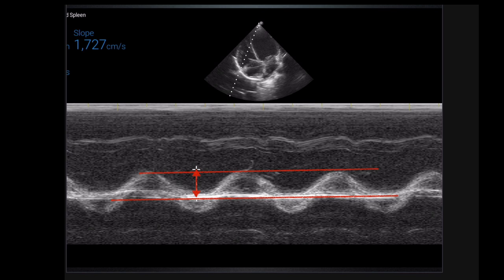TAPSE stands for Tricuspid Annular Plane Systolic Excursion — how much the tricuspid annulus moves per contraction. To measure it, put an M-mode cursor through the tricuspid annulus in apical four and measure the distance between the peak and the valley of the M-mode tracing. I draw a line through the peak and a line through the valley and measure between the two lines. If TAPSE is 1 cm in this patient, that's a terrible TAPSE when 1.6–1.7 would be low-normal.